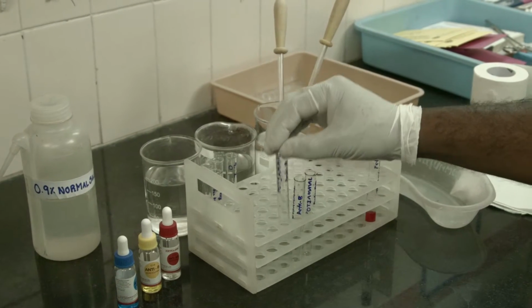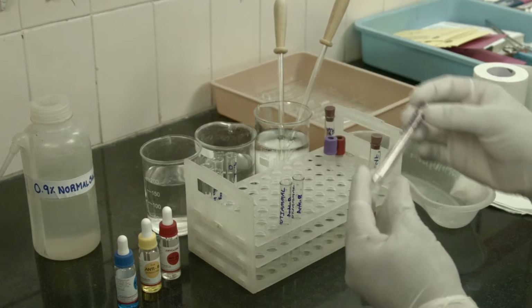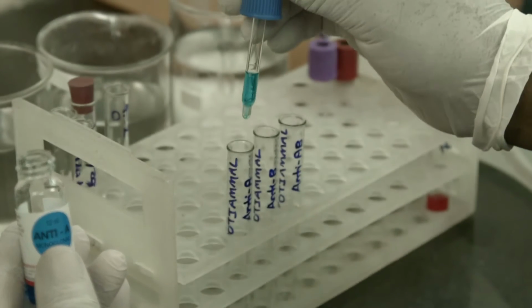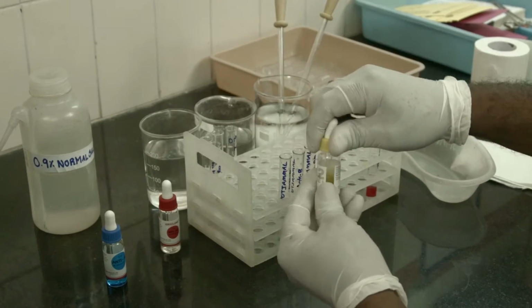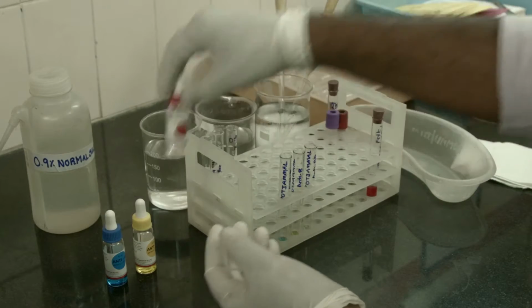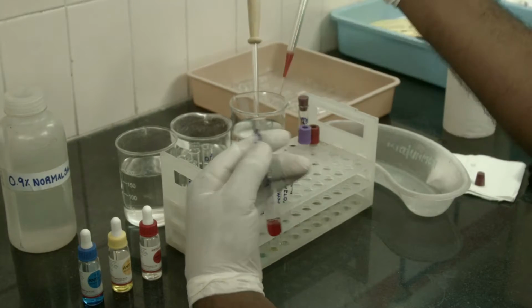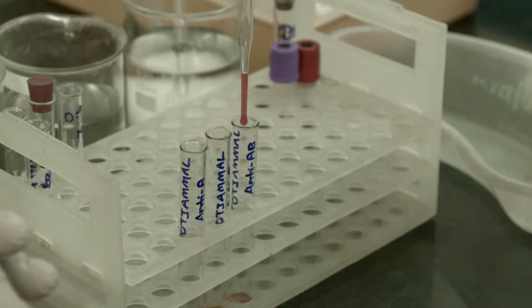Step 3. Now we will see the procedure for cell or forward grouping. Set up 3 rows of clean test tubes and label them Anti-A, Anti-B, Anti-AB. Anti-AB testing is optional. Add 2 drops of reagent anti-sera Anti-A, Anti-B, Anti-AB in the respective tubes. Add 1 drop of the prepared 2 to 5% cell suspension of test sample to each of the test tubes.